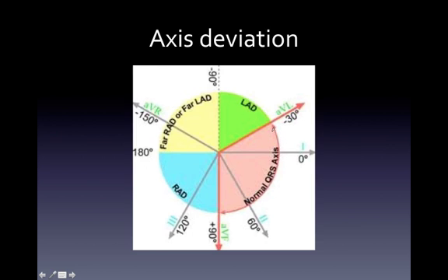So some people have a larger left ventricle. It is very easy for us to see what is considered a physiological left axis deviation. So we give a 30-degree variance on this numbering. So it can be anywhere from negative 30 degrees all the way to positive 90 degrees as far as the direction of the electricity, and we would still consider that normal axis.